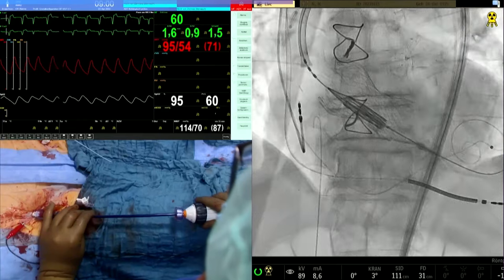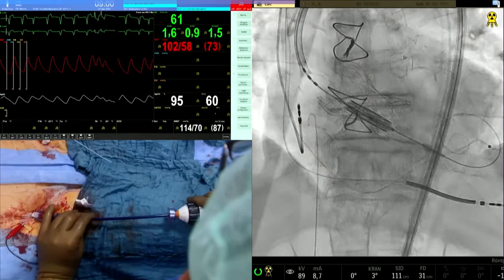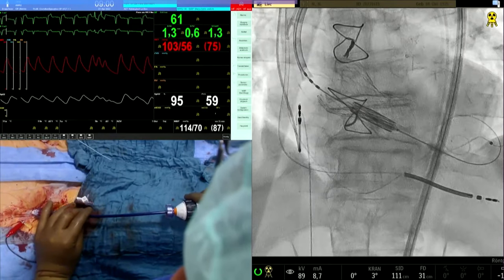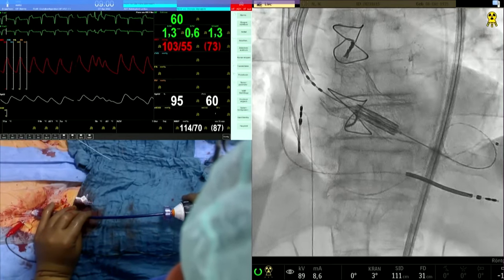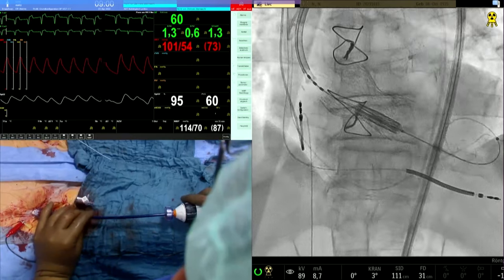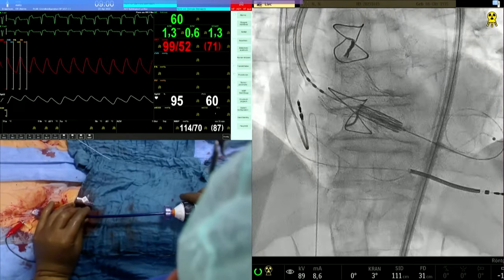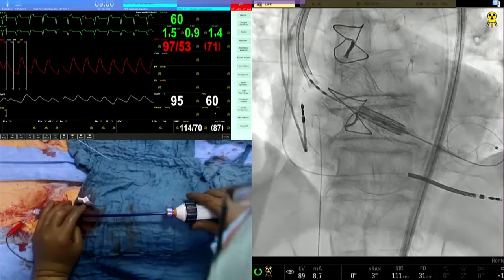Do you have the wire? Right. Okay. Big device, long device, so we'll go down. And we are now concentrating. It will shorten up from below. So we're not focusing actually on the inflow of the Sapien. We're more or less focusing on the outflow of the Sapien valve. So I think we are now approaching node 6.